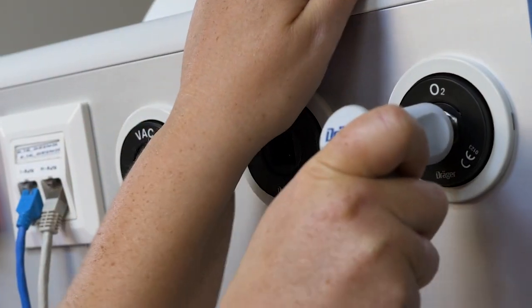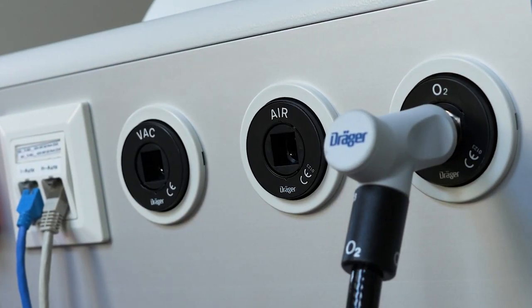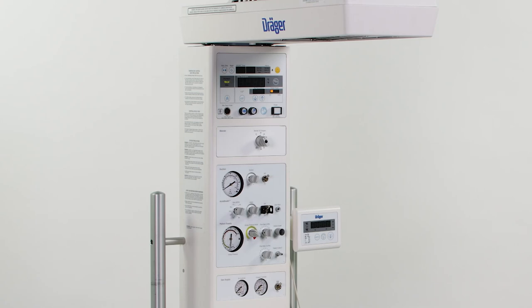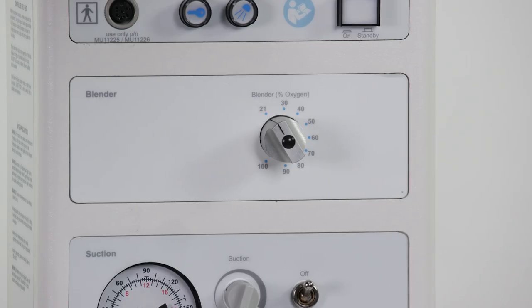To use blender suction and the resuscitation module, make sure the gas supply is connected. At the top of the resuscitation module is the blender module. This feature allows for a mixture of oxygen and air in order to deliver mixed gas to the patient. The range is from 21% to 100%. This is delivered through the primary patient outlet.